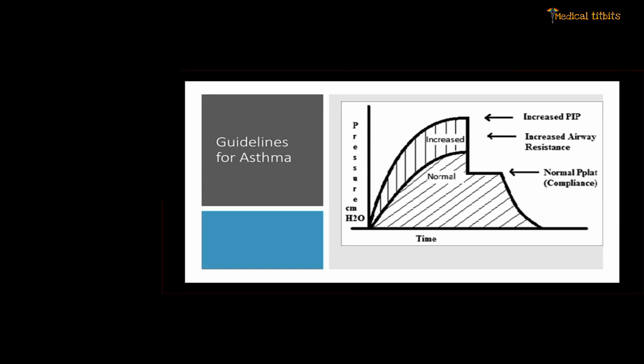But of course, in these patients with emphysematous changes or chance of bullous rupture, you need to anticipate a pneumothorax incident, but you can keep monitoring for that. For the time being, keep the plateau pressure in check, and you need to accept a higher peak pressure until your bronchodilators and your other mechanisms to control the primary trigger, like antibiotics and sepsis control, work for the patient. Then this gap will definitely come down as the exacerbation is controlled.